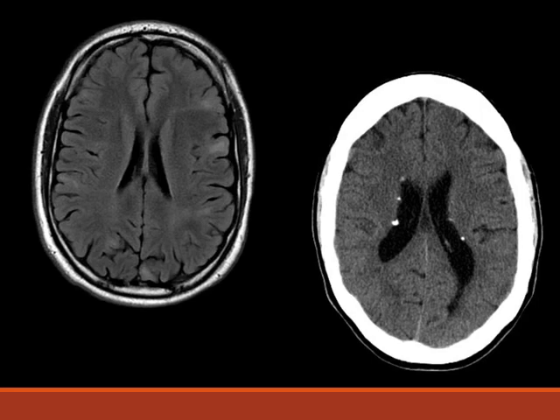So how can you tell the difference between a SEGA and a regular subependymal hamartoma? Well, the answer is it's very difficult. We do it by serial measurements. So a subependymal hamartoma, I've already said, can be calcified and can enhance. So that's not going to help you differentiate it from a SEGA. When a subependymal hamartoma begins to grow and you follow it on serial measurements getting bigger and bigger, that's when you worry about it developing into a SEGA.